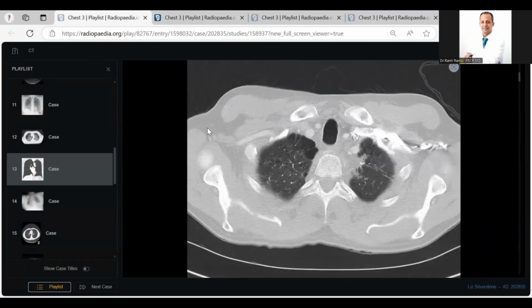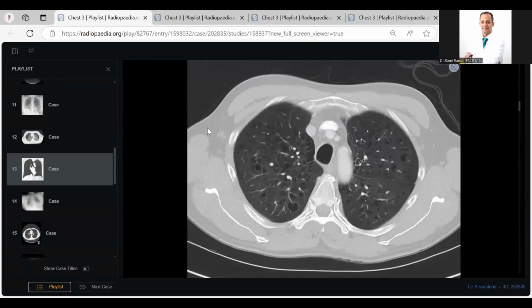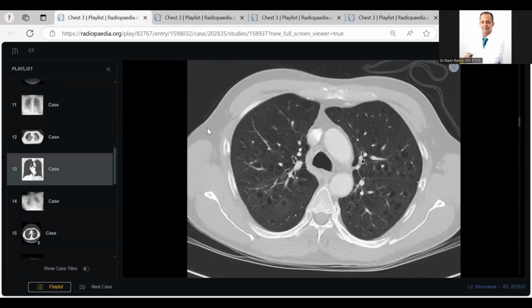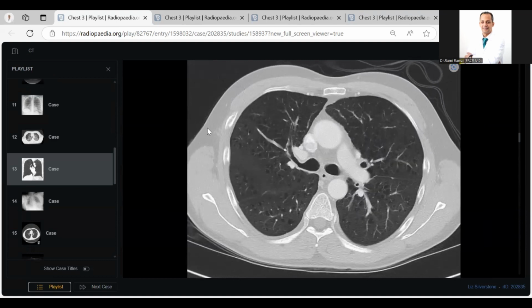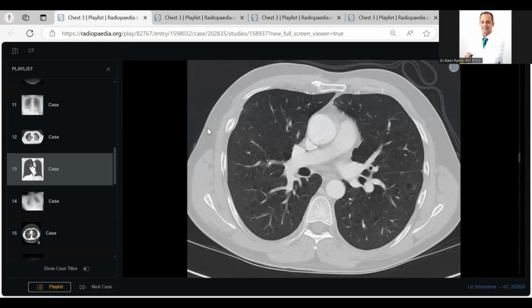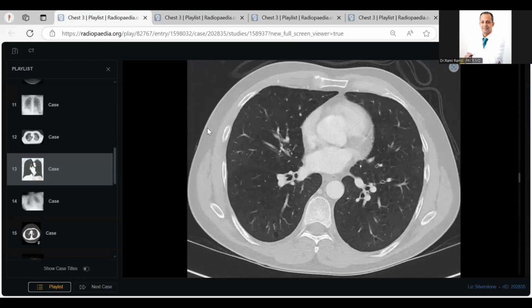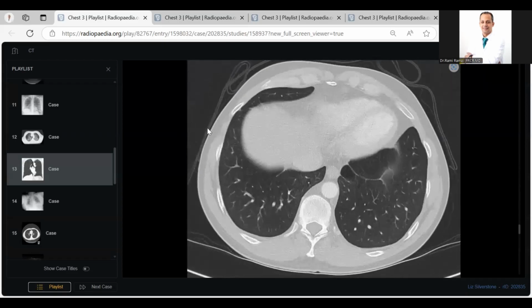This one. Why? This is an example of a very easy case. My candidate, I remark that most of you blocked in easy cases. Expect the exam will contain very clear and classic cases. I think in my exams, I get not less than 30 or 50% of them as very classic cases. And by the way, I do as you did. I get mentally blocked, by the way.